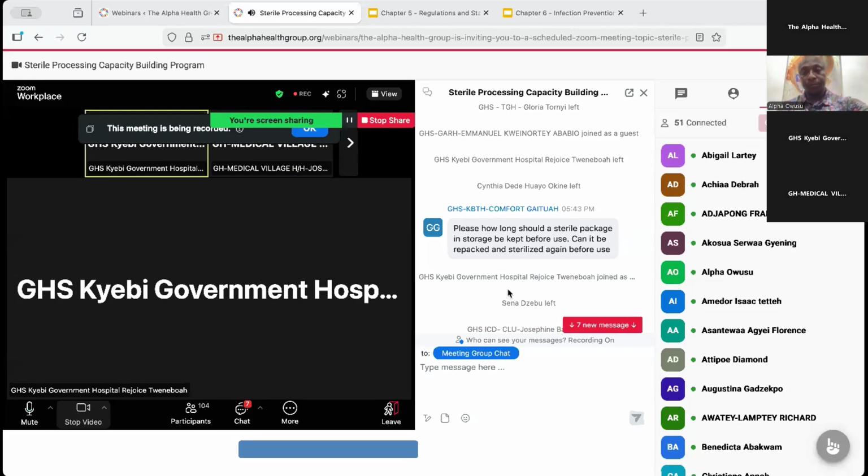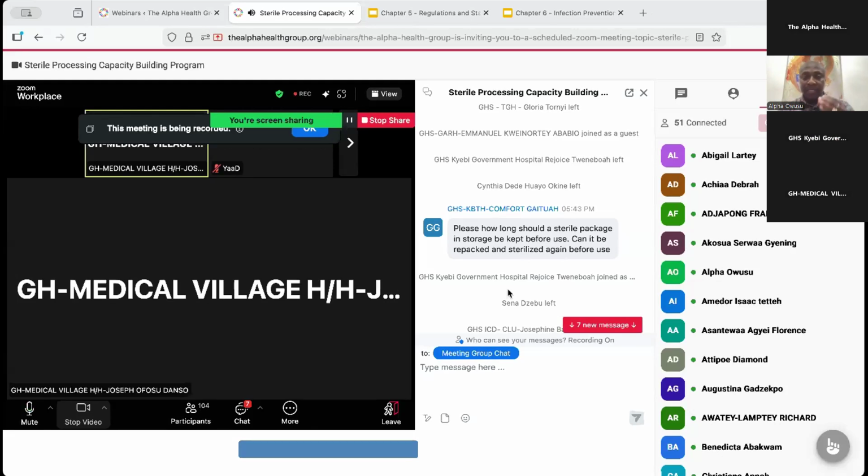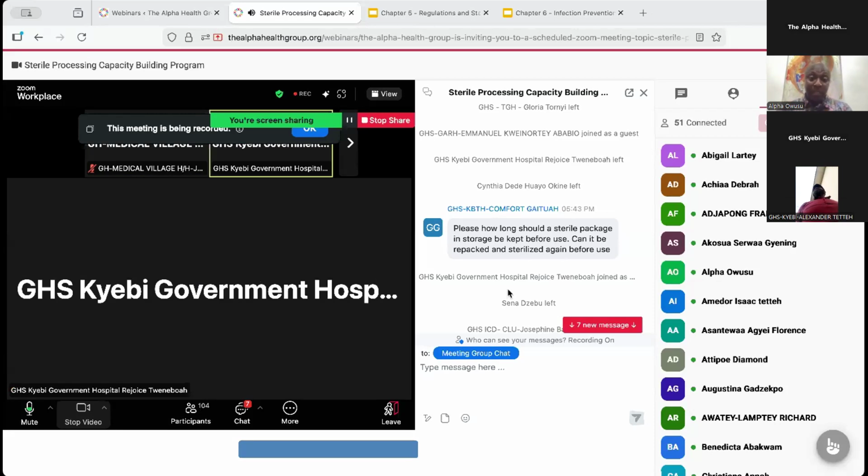No. So we have something we call, you remember in my first presentation, I said point of use cleaning. The cleaning starts at point of use. As soon as you finish the procedure, whilst the patient is being taken away, the cleaning should start where the procedure happened.